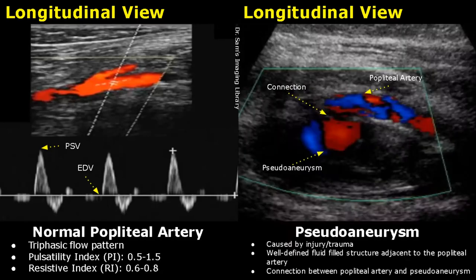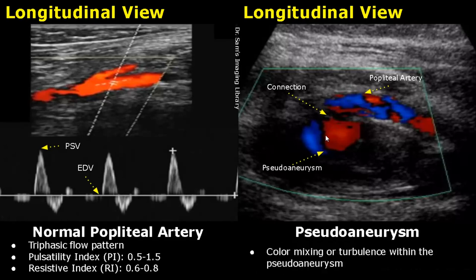A pseudoaneurysm occurs in case of injury or trauma to the popliteal artery. A well-defined fluid-filled structure can be seen adjacent to the popliteal artery, and we will find a connection between the pseudoaneurysm and the popliteal artery. We will also find color mixing or turbulence within the pseudoaneurysm — we can see a mixing of colors, both red and blue, inside this pseudoaneurysm.